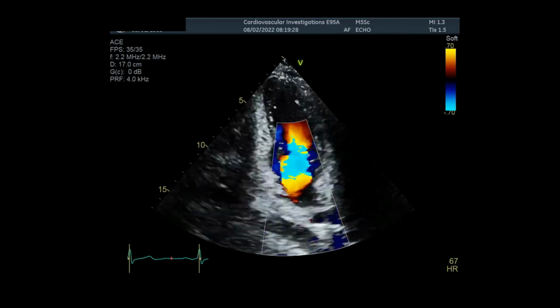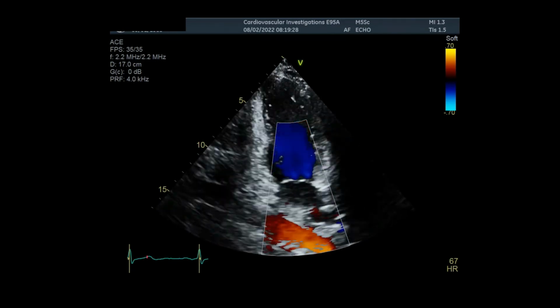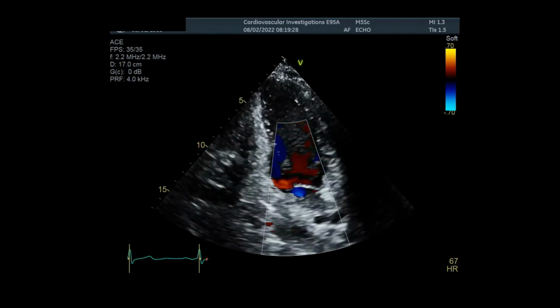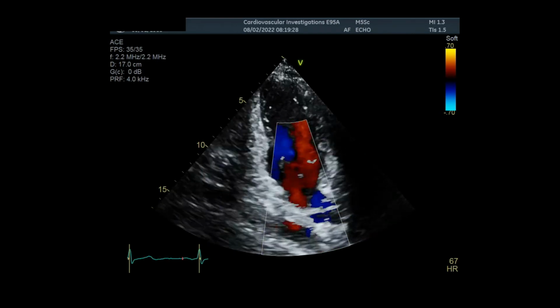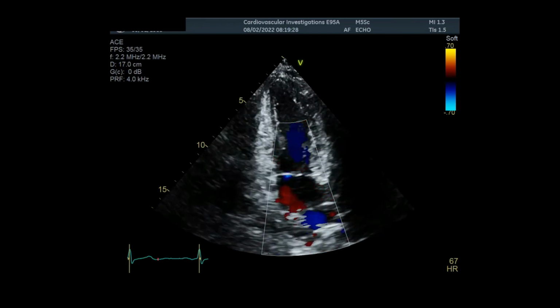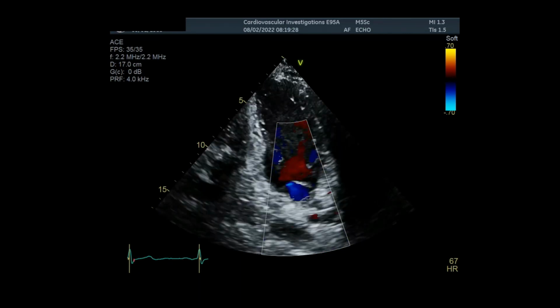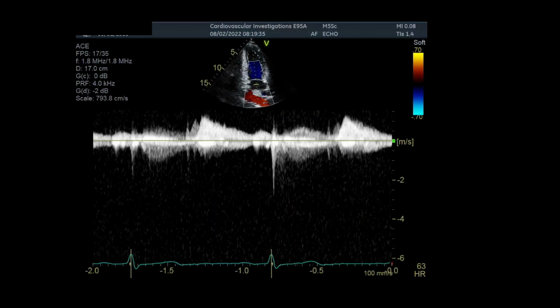And if you haven't been satisfied with the apical 4-chamber images, or you've been unable to adequately line up your Dopplers, you can repeat or perform measurements that we've discussed previously in this view. So you could do CW and pulse wave Doppler through the valve in this view as well, for example.